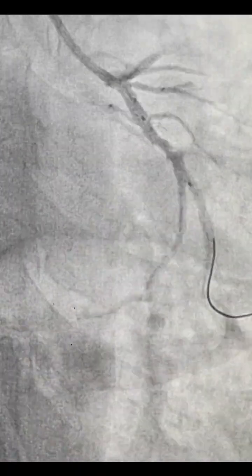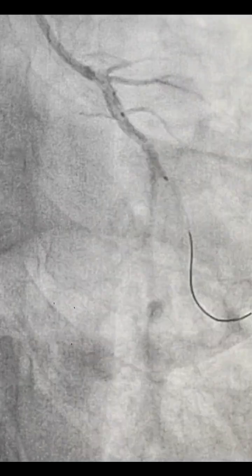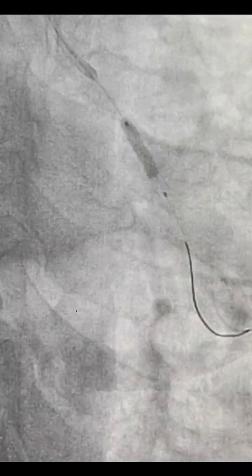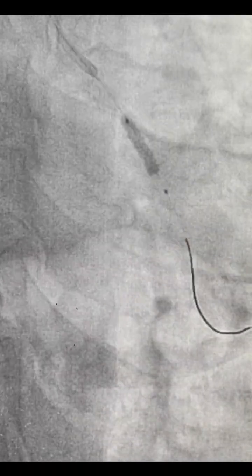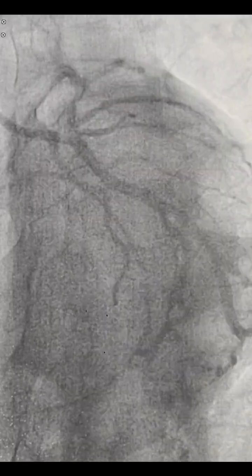and this is the placement of the stent. We could have taken a smaller length stent, but this was okay. This was an 18 stent, 2.75 by 18. We deployed the stent at around 12 atmospheric pressure. Nominal was 8, RBP was 16, and this is the scene after LCX angioplasty.